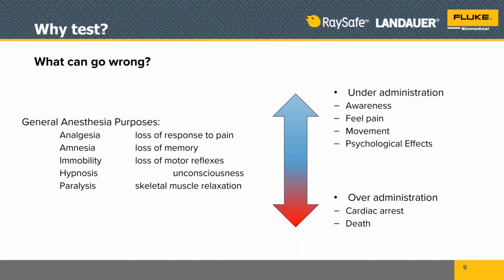Yeah, just to add some color to under-administration, put yourself in the patient's shoes. Imagine that you're lying there on the bed and you're feeling pain and you're aware of what's going on. You're watching cuts being made, you're feeling the pain, but you can't move and you can't speak. Imagine what that would do to you at a psychological level. Imagine the trauma that's going to put you through and the burden you're going to bear for the rest of your life. That's one of the dangers, right? But obviously the physical dangers are cardiac arrest and death from over-administration, which we don't need to explain any further.